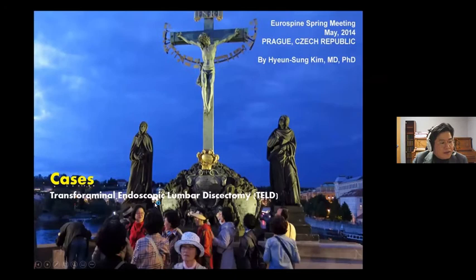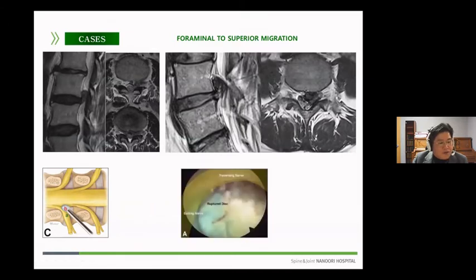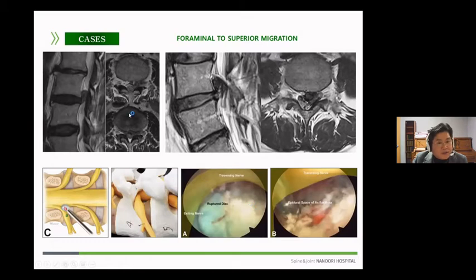Let's look at cases found in transforaminal endoscopic lumbar discectomy. Here we can see the foraminal-to-supra migrated disc. Foraminal-to-supra migrated discs are often difficult in open surgery. However, in transforaminal endoscopic lumbar discectomy, if we use the foraminal route, damage to the surrounding structures can be minimized while resolving this problem, as seen here.